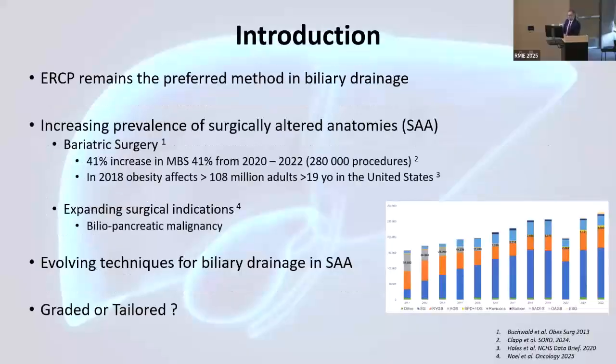So just to mention up front, I think ERCP remains the preferred technique for biliary drainage if amenable to it, and keep that at the forefront. However, there is obviously an increase in prevalence of surgically altered anatomy cases, largely because of our increased incidence and prevalence of bariatric surgery. But we're also having expanding indications with regards to our current pancreatic biliary malignancies. Fortunately, parallel to that is this repertoire that's expanding with regards to options in order to deal with this.